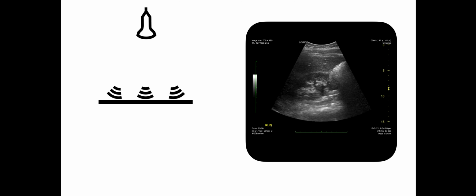For completeness, we'll touch briefly on some of the other modes and why we have them and the features within ultrasound. But sometimes it can get a little bit overwhelming, but we'll try and work our way through it fairly quickly. In our standard ultrasound 2D brightness mode imaging, we send multiple beams across multiple different directions, each being reflected to come back to create multiple different dots across our screen that then get interpreted and reflected on the screen multiple different times.